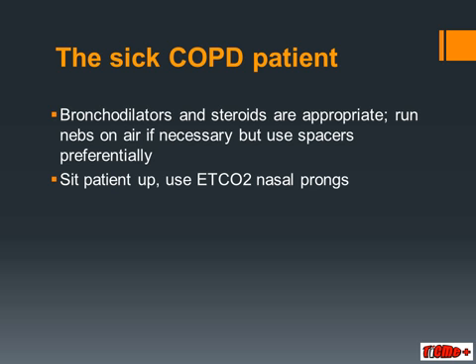Remember to always sit your patient up, and if you have them available, using end-tidal CO2 nasal prongs for monitoring is a good plan. You can calibrate these with your first arterial blood gas so you can see what the alveolar arterial CO2 difference is, and then after that you can use your end-tidal CO2 prongs to track progress.